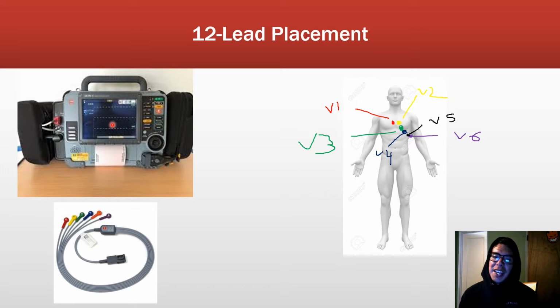And one of the most common things, pause for a second after you say that, because usually you'll say, hold still so we can get a picture, okay? And they'll say, okay. It's like, well, that just messed it up. So give them a second, because they'll probably say okay, and then wait for it to go normal and then push the button. But yeah, that's just how it is.